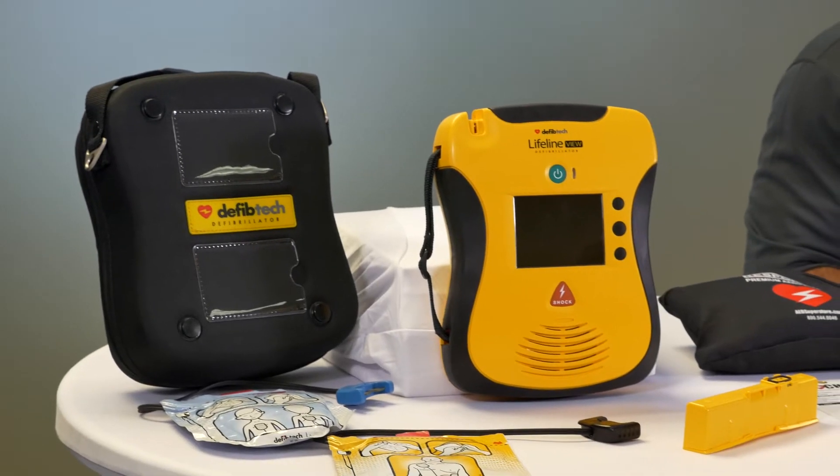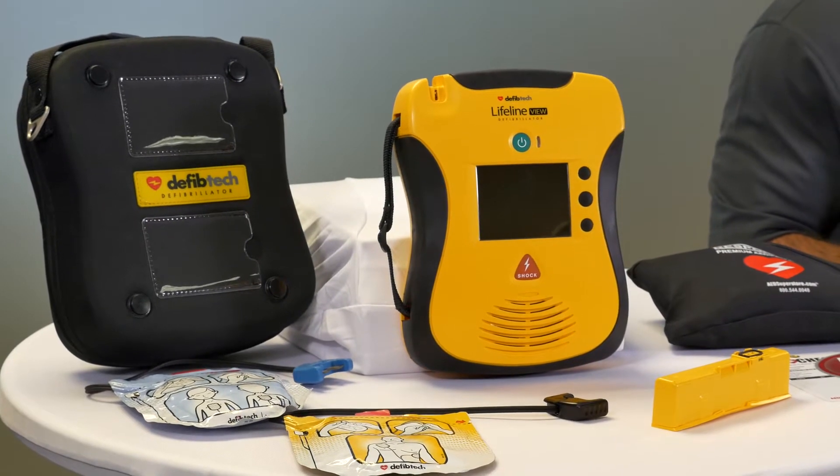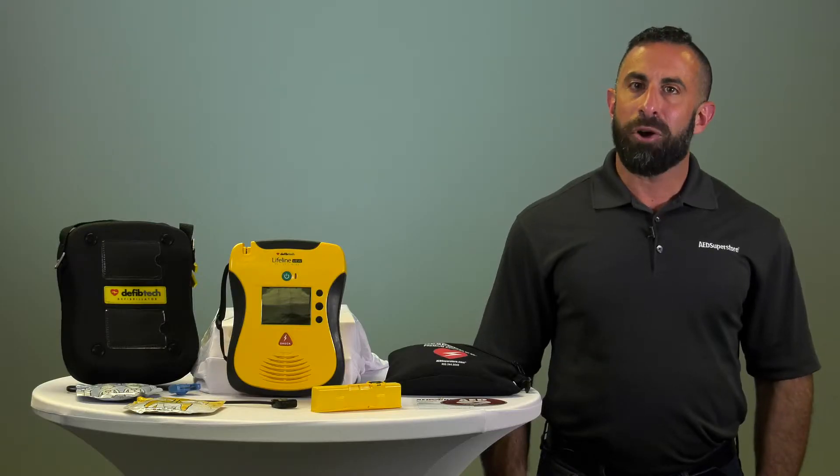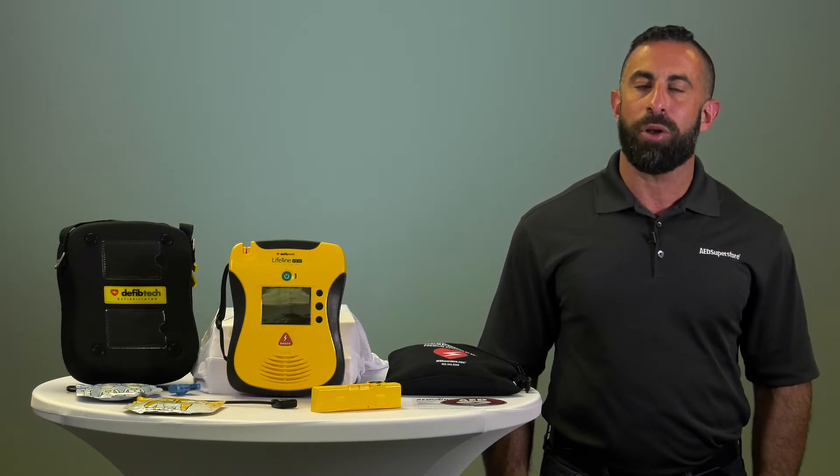This is also a very easy-to-maintain device, with a one-touch status screen that shows the readiness of both electrode pads and battery. The device also has built-in video which gives easy step-by-step guidance on maintenance.